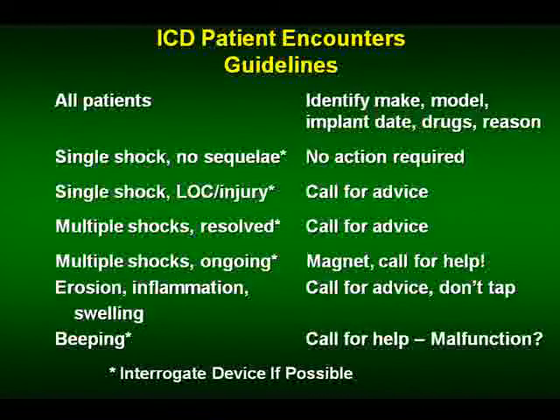And the beauty of defibrillators is that they're designed by engineers. I'm insulting some engineers in the room, I'm sure, but there are all these beeps or warnings, and that means something's happening, but it can be anything from, by the way, next Tuesday you have an appointment with your doctor, to this is going to blow up in a few seconds. And without a programmer, you can't tell. And most of my patients can't hear. Unless they think it's their hearing aid. It's amazing. I thought it was my hearing aid until the lady at the checkout counter said, "What's that noise?"